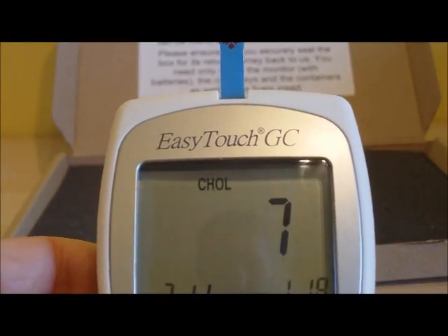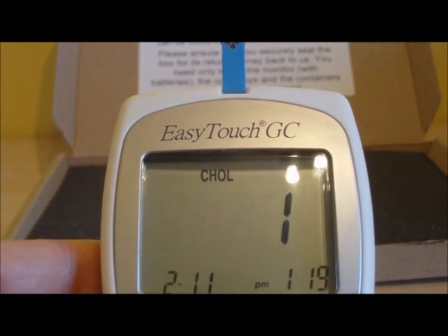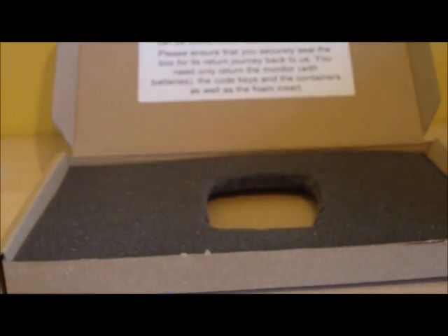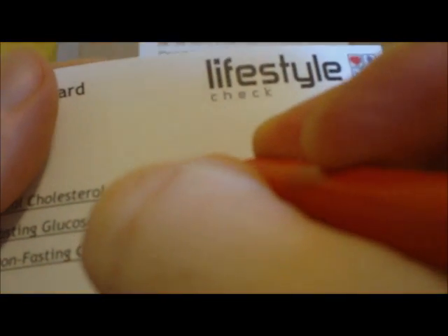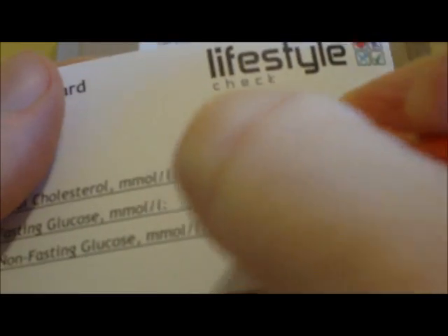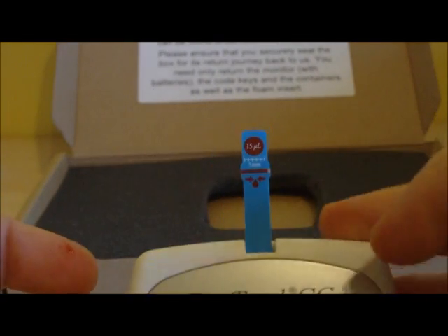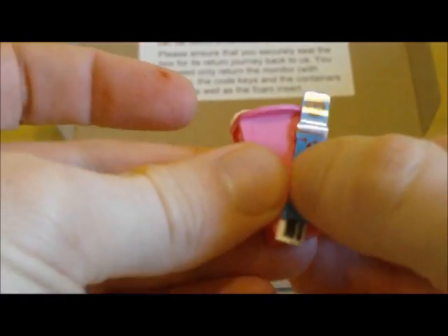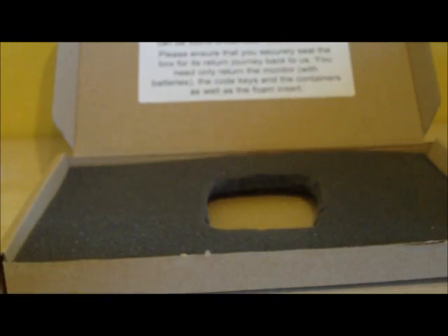We are now counting down the last few seconds of our cholesterol measurement. It takes about 150 seconds and once counted down you will see your total cholesterol level displayed — in this case 4.7. You can then write that on your results card as a record of your cholesterol level. Now take your test strip out of the machine and together with your lancet and any tissue used to mop up your blood, that can all be discarded.